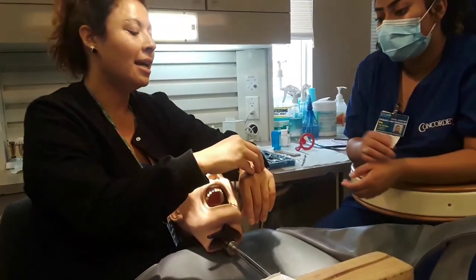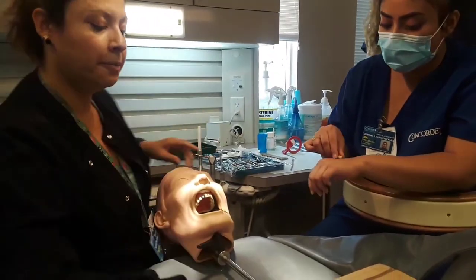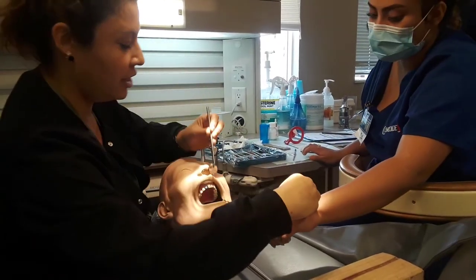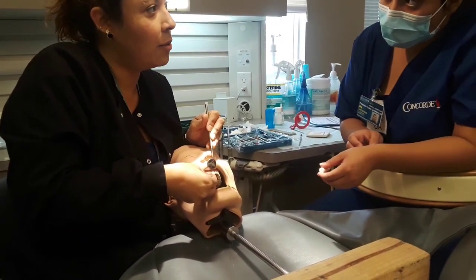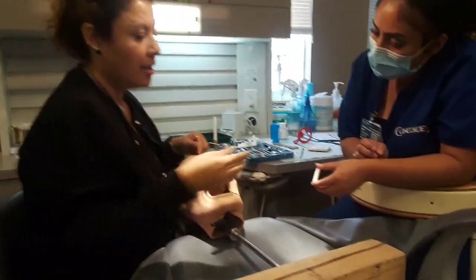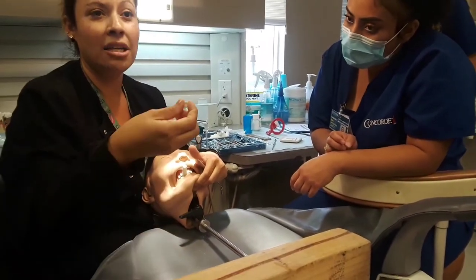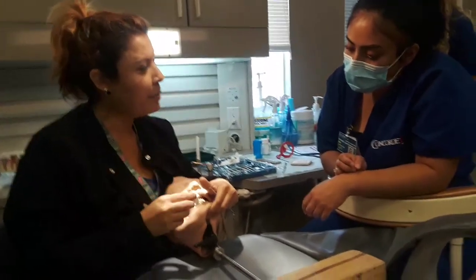You should have a cotton roll ready. I'm going to put this on and press first with my hand — that sets the crown all the way to the margin with force. Then I'm going to have the patient bite on the cotton roll to make it hard. This has a three-minute set time, so they'll be biting on the cotton roll for three minutes.